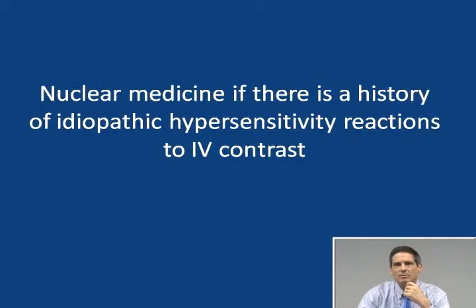If you see multiple mismatches with ventilation going to areas of the lungs where there's no perfusion, then that's diagnostic of pulmonary embolism, basically. If you see a perfectly normal perfusion study, that essentially excludes pulmonary embolism. A lot of studies are indeterminate, however, and kind of fall between those two.